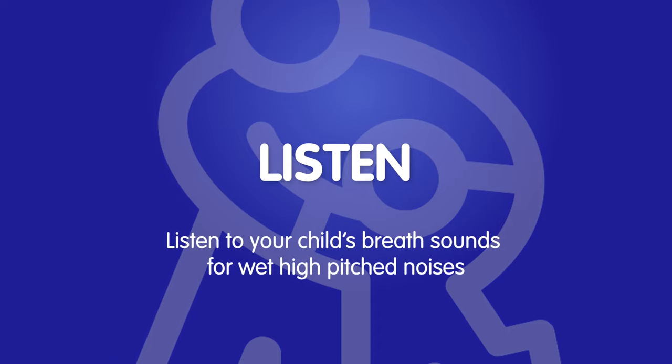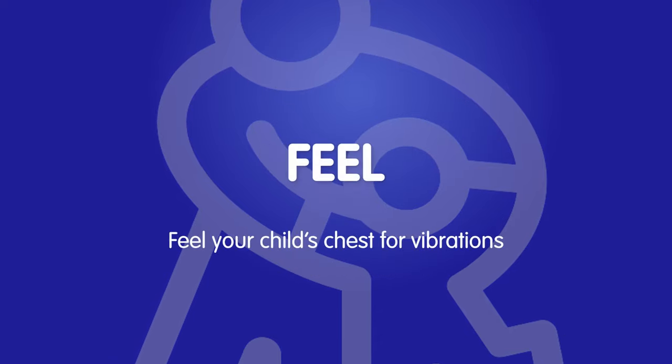Listen to your child's breath sounds for wet, high-pitched noises. Feel your child's chest for vibrations. This may be coming from secretions building up in the lungs.